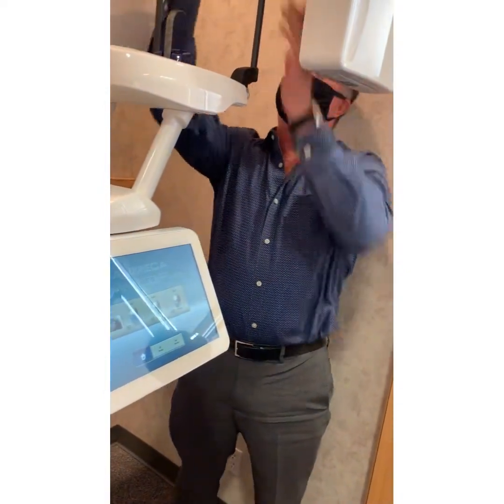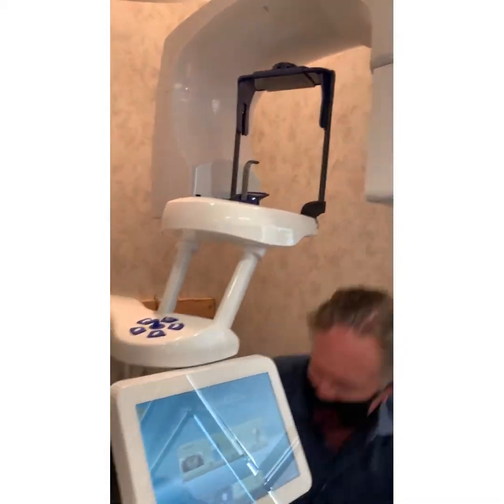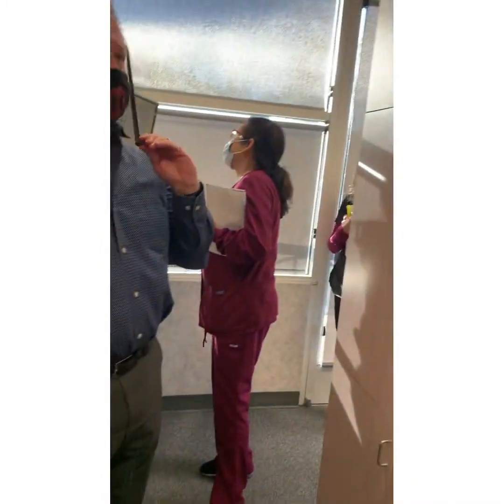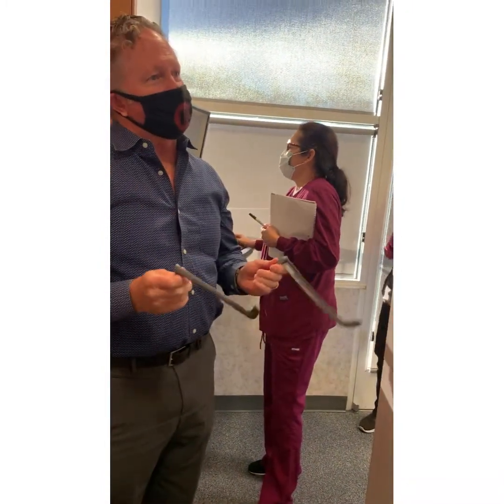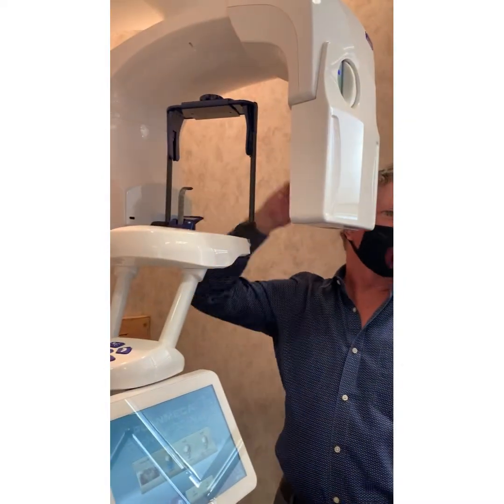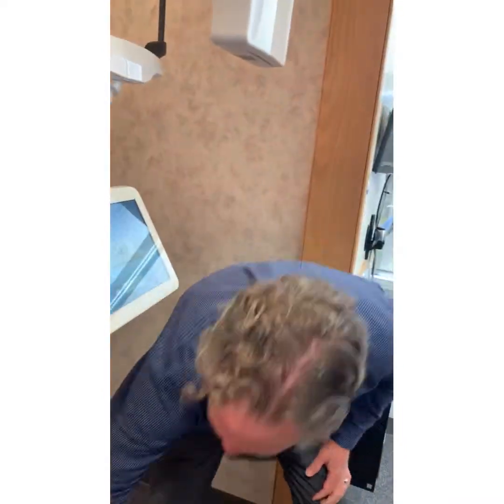So does that stay put together or do you change? Oh, I see. So this will stay there. If you call Planmeca, they're going to tell you that you're going to use these for pan. And if you tell them that Doug said that we don't have to, I'm totally going to deny it. But you can use this. It still provides the support. You want five points of contact while you're taking a pan, to keep people from moving around. And what about people who have a bigger head?